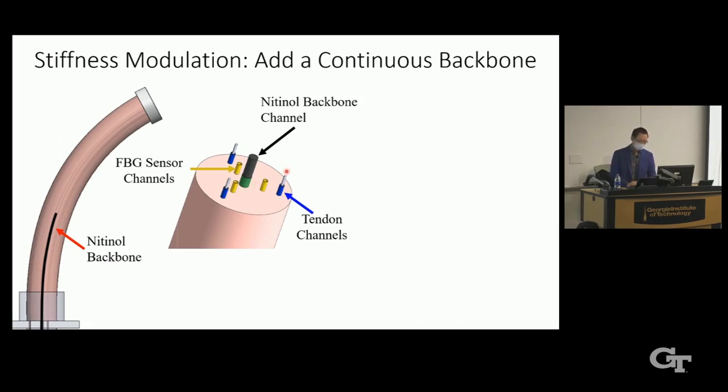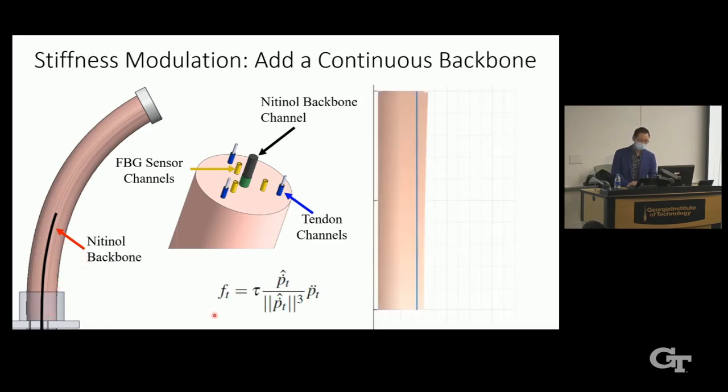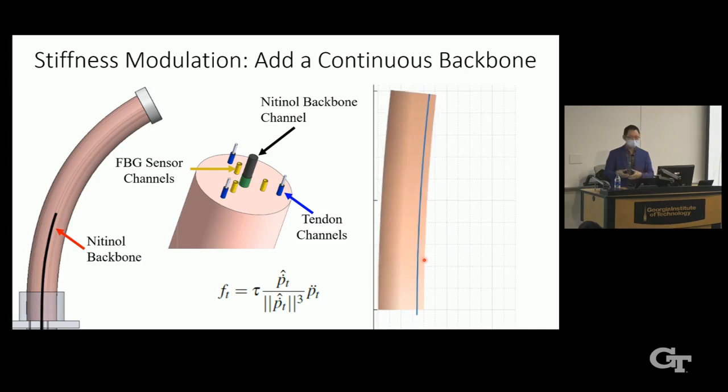So with this hardware, we need to consider its modeling. Still, we use the Cosserat rod modeling. But here, it's slightly different because we have the tendon-driven force. So we need to consider the tendon force here. And this is the force we want to integrate into the previous Cosserat rod model I just described in the constraint tube. So with this tendon force, we can describe the deformation subject to a given force. So we developed the model and fabricated the hardware.